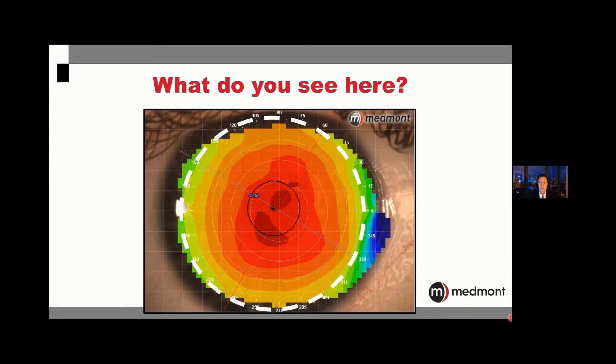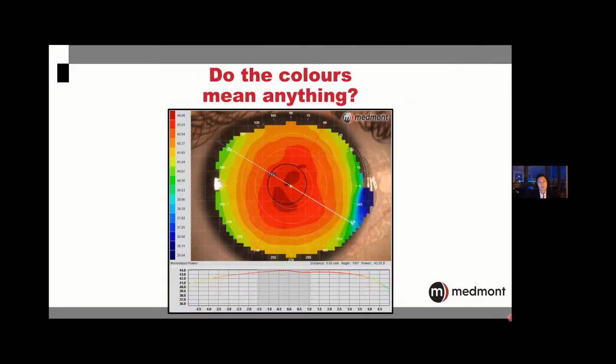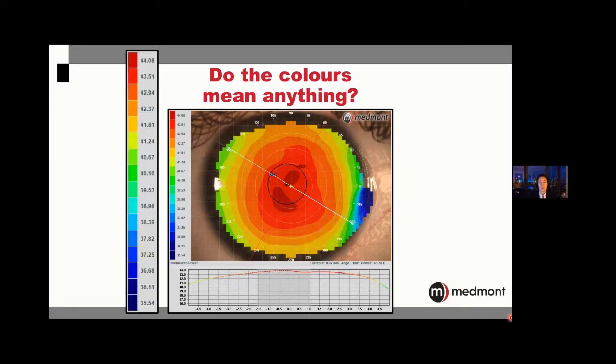So that's kind of a helpful understanding, because if we see a highly displaced corneal cap that might suggest the lens won't center well, we won't be surprised if we go down the orthokeratology path and that lens wants to decenter. But here we see a very symmetric, well-centered eye. Now, what about the colors that we see distributed across this eye? One of the first things that you might do, at least what I'd suggest to do, is use what's called a normalized scale. And what that does is it distributes all of the colors that you can see across this particular eye and its related radii.